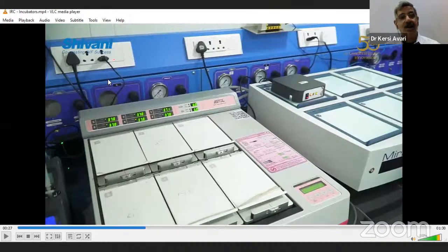And remember, all of these electrical points are connected to a UPS, uninterrupted power supply, with a sine wave inverter fitted with a stabilizer. So there is no voltage fluctuation, there is no trauma, because in places where sudden power failures take place and they have not fitted themselves with backups, these incubators suddenly start beeping.